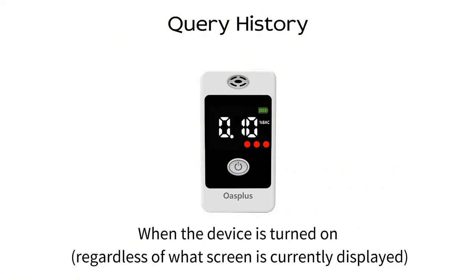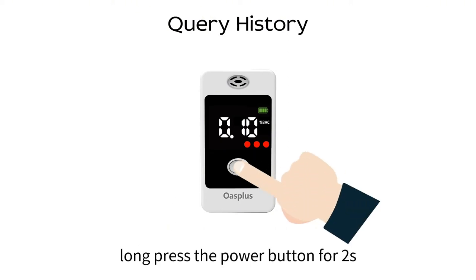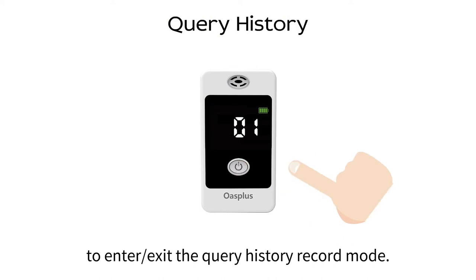Query history. When the device is turned on, regardless of what screen is currently displayed, long press the power button for two seconds to enter or exit the query history record mode.